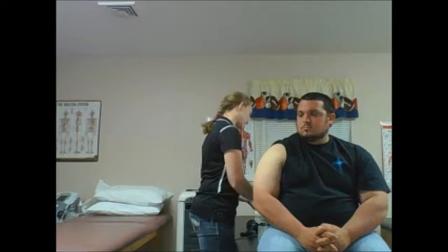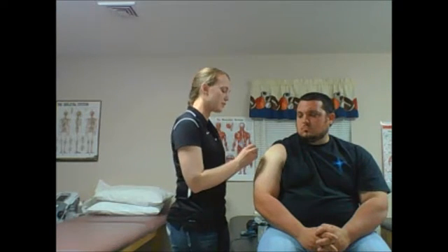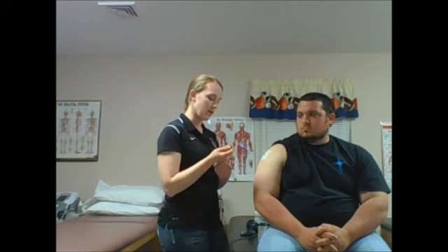Okay? Also, if you're using a syringe, just to help the patient feel comfortable, be sure to explain to them that I'm not going to inject some needles into you. It is just for the medication purposes. Once I have the medication applied, I'm going to apply the Iontophoresis pad with medication onto the spot of pain. Now it is positive, so you want to use the positive lead to hook it up to it. So I'm going to go ahead and do that.